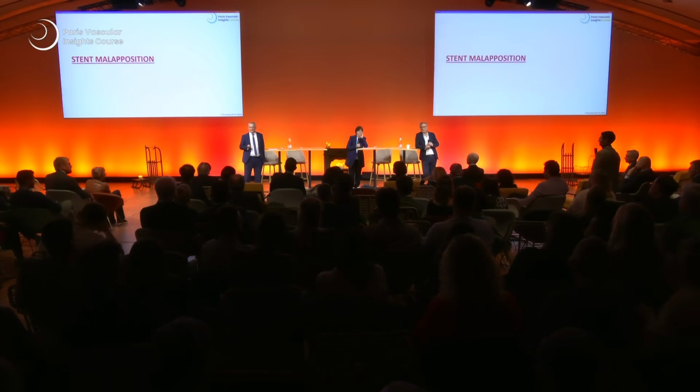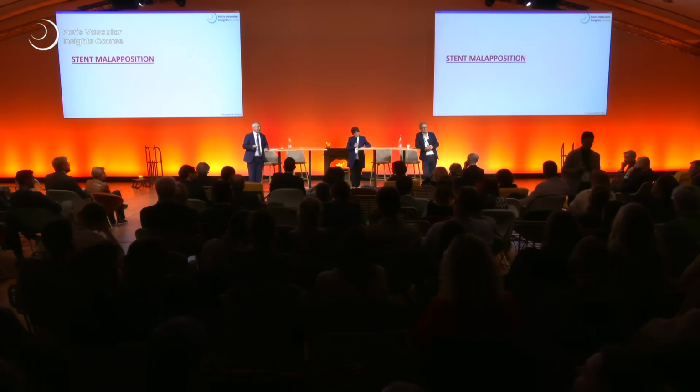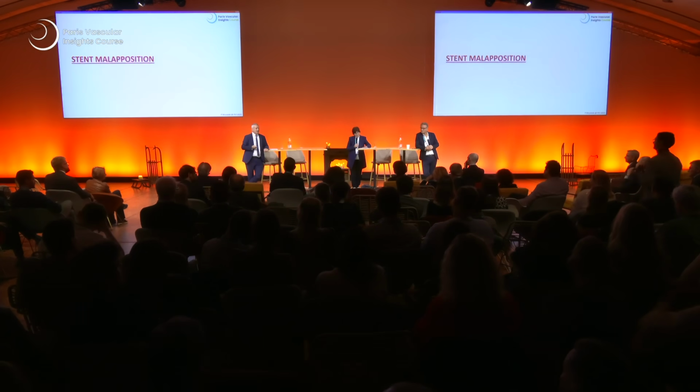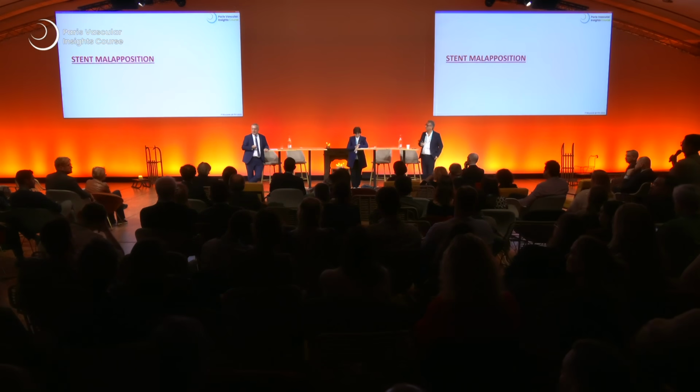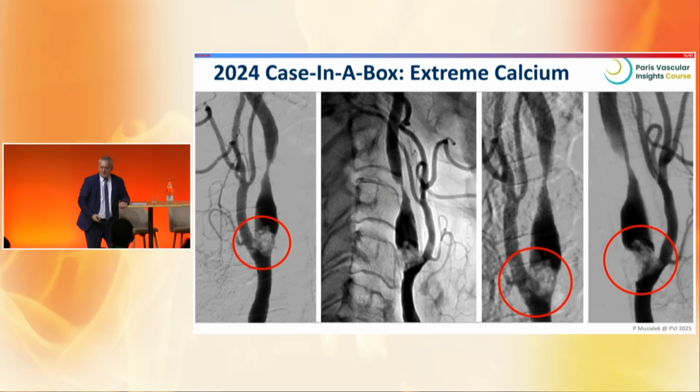Has anyone seen stent thrombosis in the carotid artery? Yes. What were the factors? It was due to neoplasm, actually, somebody with an active malignancy, so it was not related to malposition. Okay, a procoagulable state. I understand. Other reasons? I've seen this from other centers, patients with examples of stent malapposition. So stent malapposition is a risk factor also for stent thrombosis and embolism.